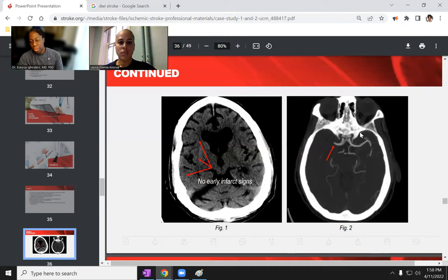Now, the right panel is a different image. So, Andrew, if we were presenting this on rounds, how would you read it? This is a CT angiogram, axial view. Is this the neck or head? This is head. Good. So CTA head, axial cut, highlighting occlusion of what artery is this? MCA. Proximal MCA. What side is it? The right. Very good. You just read a CT angiogram.